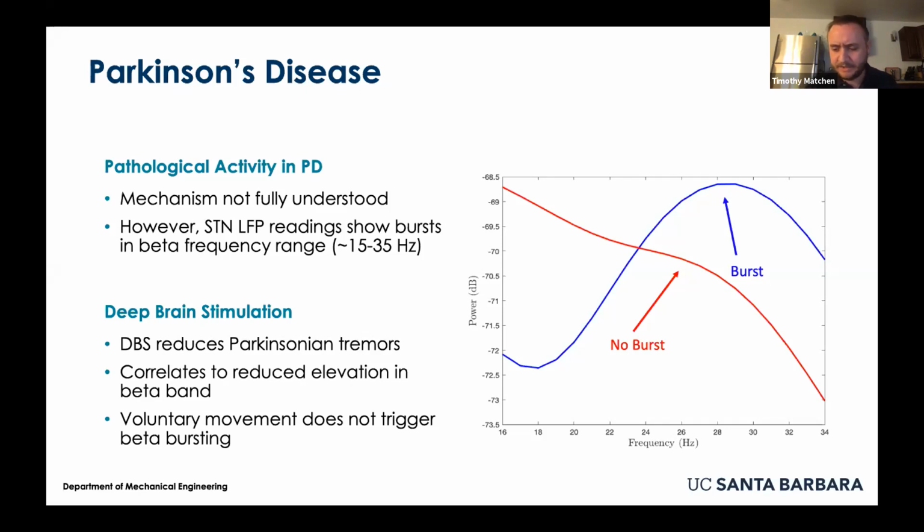This has a couple issues. One is that batteries have limited lifetimes. Another is that patients' physiologies can change on different timescales. One way that it can change is simply over the course of the day.